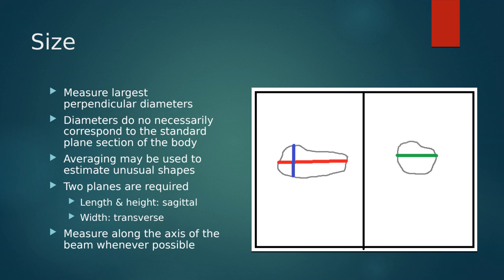And that means that the mass doesn't have to lie perfectly in correspondence with the true sag and true transverse of the patient's anatomy. So say you have patients, let's just do the patient's belly right here. So that's their belly button right here. Here's their xiphoid process up here. There are their arms, just for a little reference. So say we are looking at the patient's, let's do their right kidney. Let me change my color here. Patient's right kidney is going to sit like that.